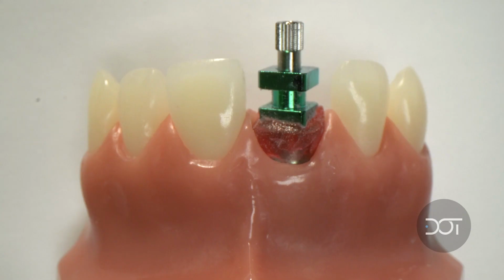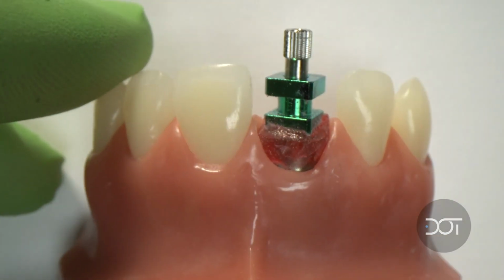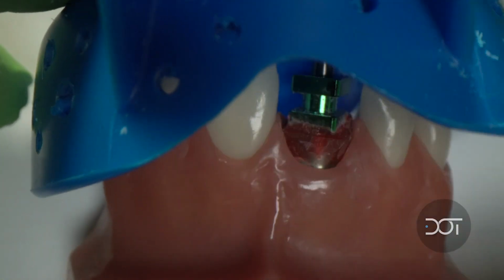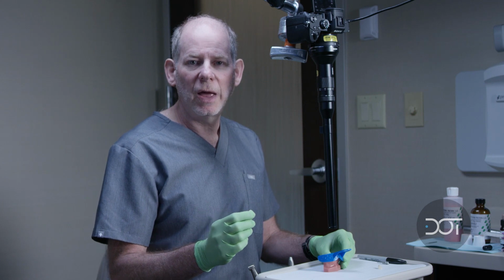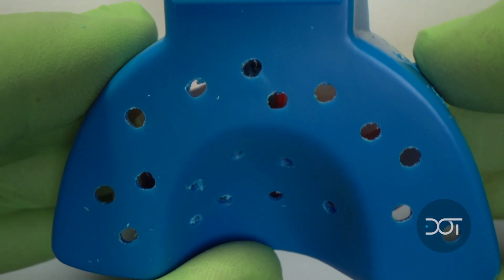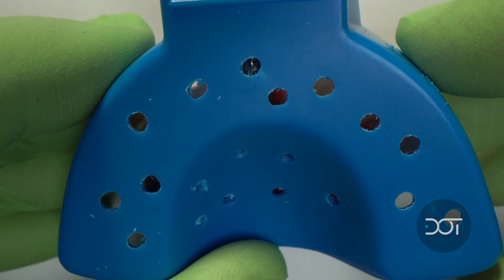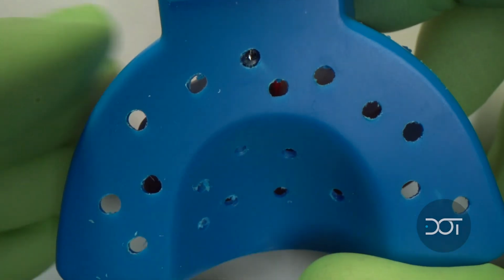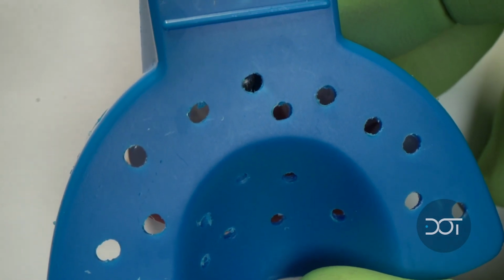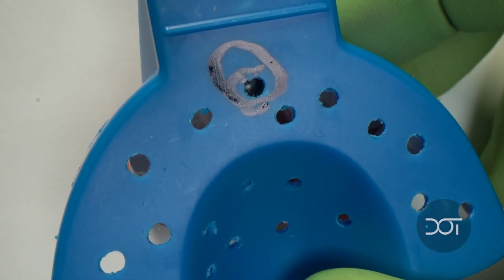So I have my model with my customized impression post already seated. I'm going to take my impression tray that's perforated. To do the open impression technique, I have to create a hole in the impression tray. I'm going to look in the patient's mouth and move the impression tray around until I can see where that impression pin or the screw is coming through. Then I'll use a Sharpie marker to draw on the tray exactly the point where I need to open up the tray to gain access to the screw.